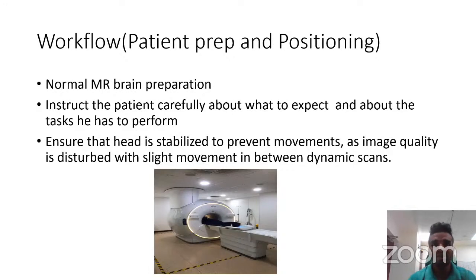So we have to educate the patient about what's happening, saying that this is to see your brain activation, or this is to see how your brain responds to different activities. So we are giving you this kind of activity. When we give you a certain activity, you should only follow and do that activity, nothing else, because if you do something else along with it, even that would bring activation to the brain.